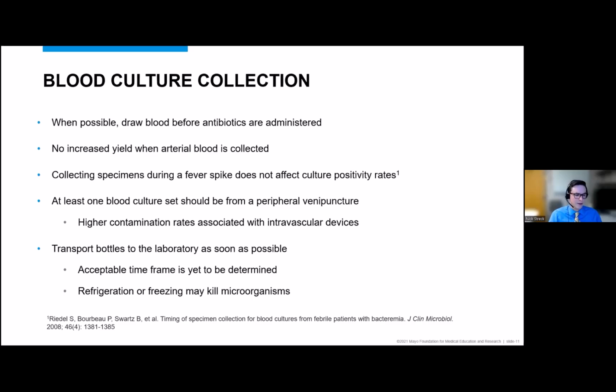And then we do get questions about transport of bottles to the laboratory. I think this comes from some of the regulatory agencies. We have checklist items that say that these need to be transported within a reasonable amount of time or as soon as possible. The reason why that verbiage is a little vague is we don't have great studies that have really identified the acceptable time frame for getting these bottles to the microbiology lab to initiate testing. What we do know, though, is that the transit time, as I mentioned, is tied to patient outcomes.